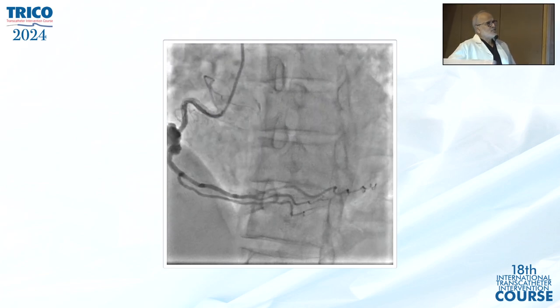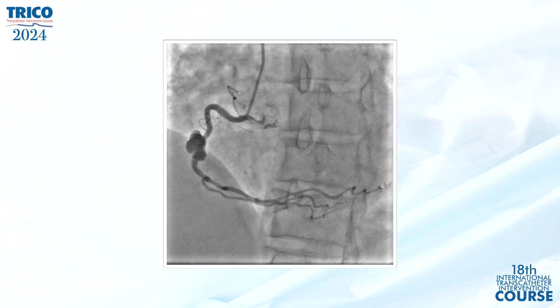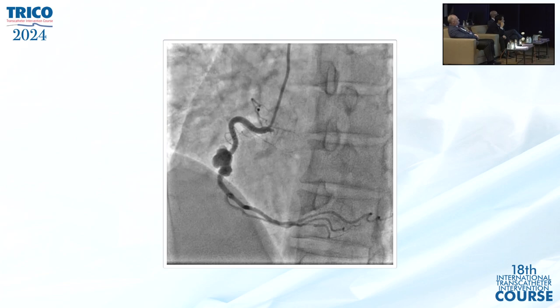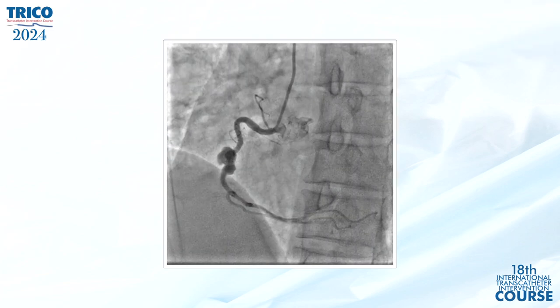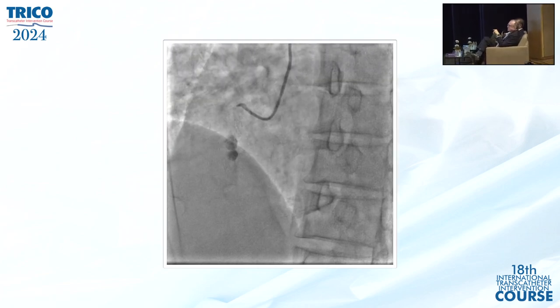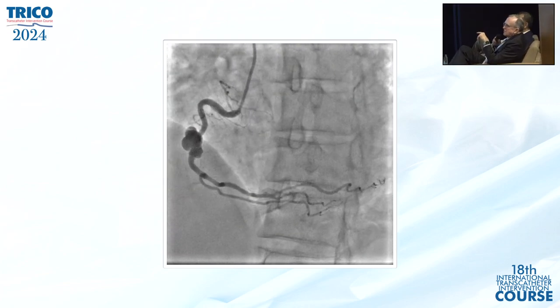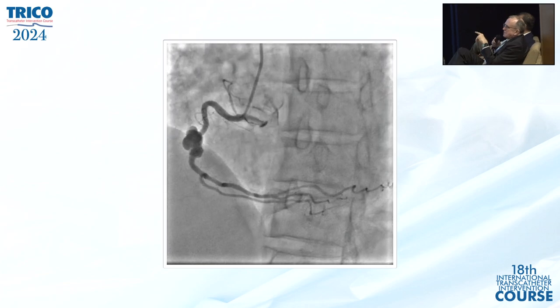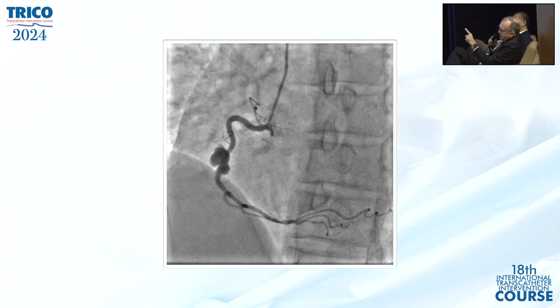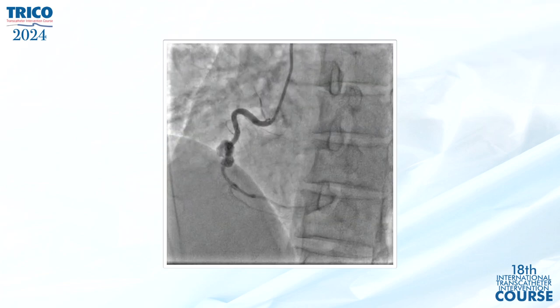2 months. Do you expect the aneurysm to develop in 2 months with the drug? Tejas, do you have the original angiogram? No, that was not done in my center. This is the one we saw. The original one where it was stented was not available with me, but the patient had an angiogram done there, and with this, the patient came to us for the aneurysm closure. But the previous intervention, was that done because of a coronary aneurysm, or is this a new aneurysm? This was a new aneurysm. At that point of time, there was no aneurysm as per that report.